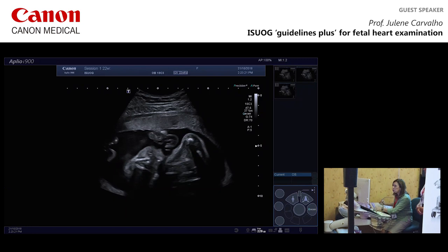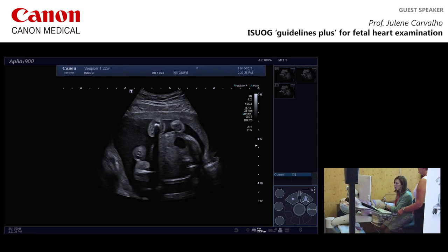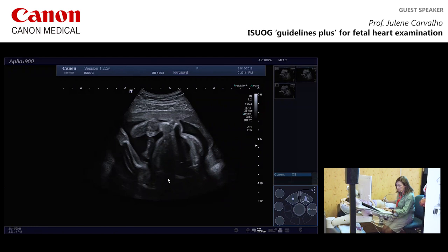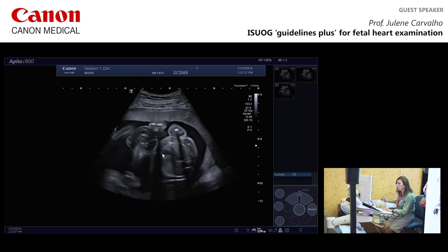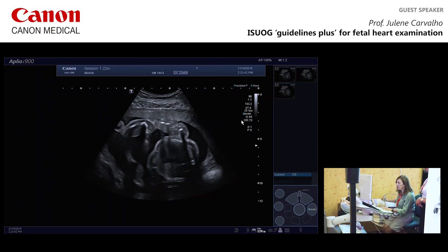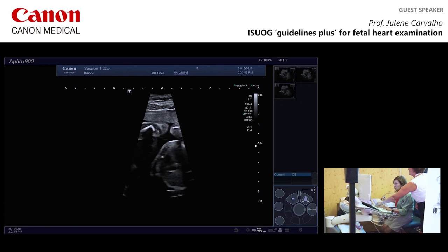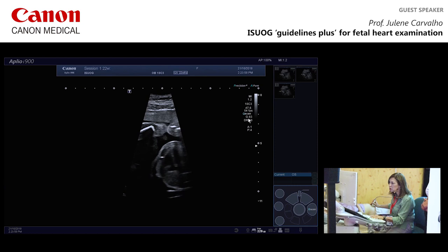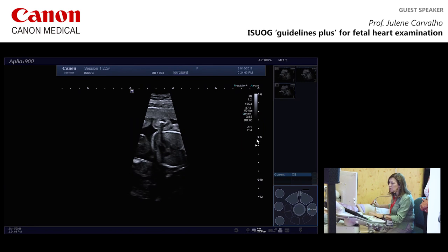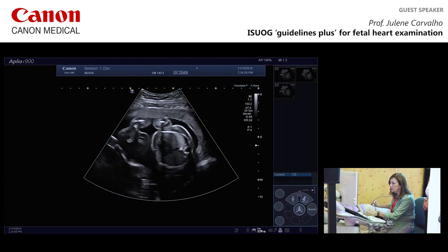This lady is 22 weeks and 6 days. We're starting with an obstetric preset, which is quite wide but soft for the heart — the frame rate is only 25 frames per second. Switching to the fetal heart preset, the frame rate immediately changes to around 50 — doubled. I tend to widen the sector initially so I can see the baby and perform an internal and external examination to find the best window.